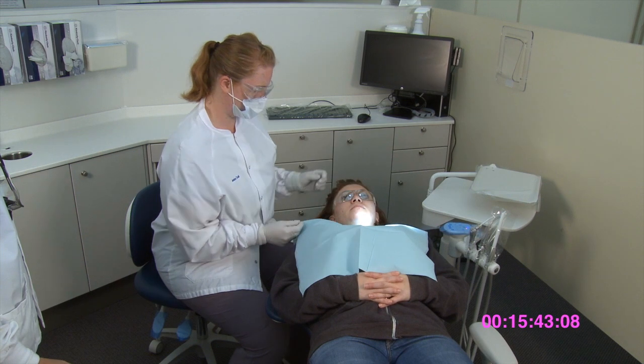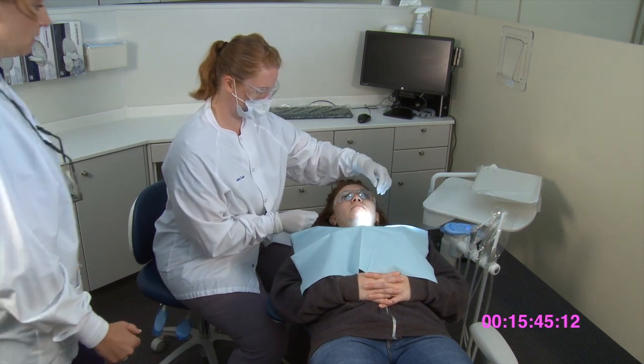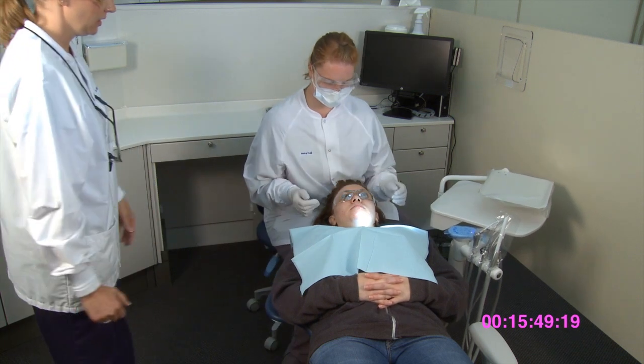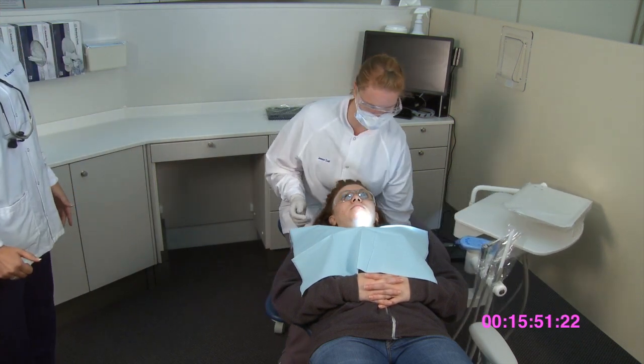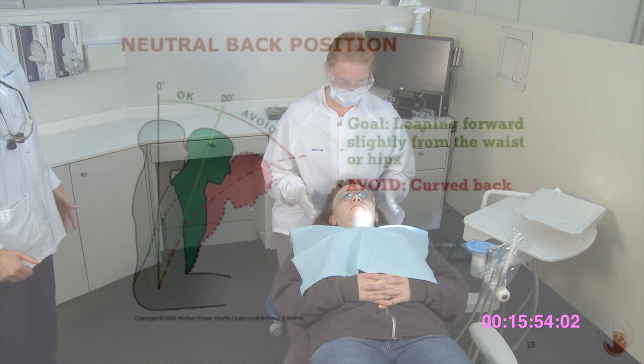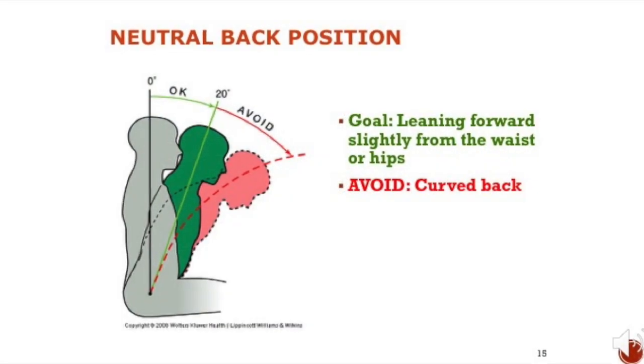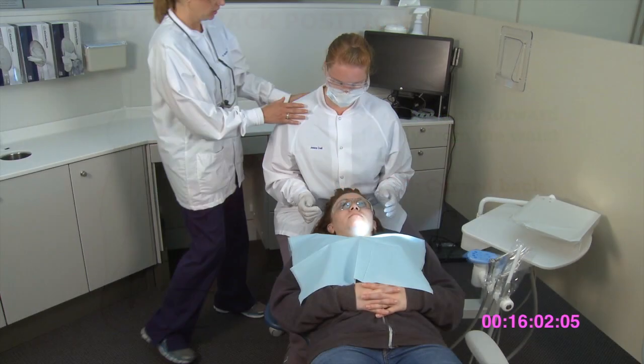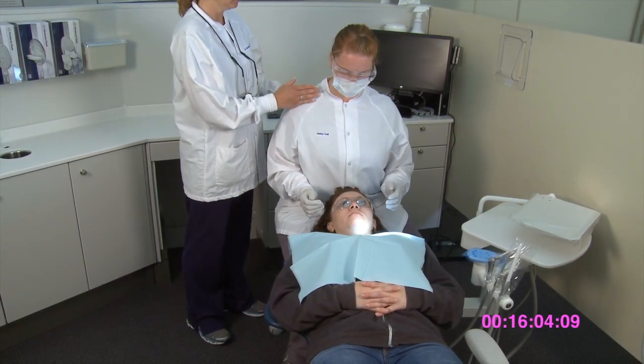Once the patient is at the correct height, it is important for the clinician to think about her posture, making sure her torso is in line with her long axis and that her shoulders are even and not hunched up to the ears, that her neck is in neutral position and not tipped too far forward or to one side, and that she avoids a curved back.